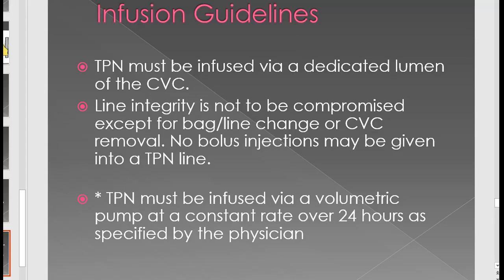As with any other kind of IV bags of any kind, it's only good for 24 hours. So at the end of the 24 hours when TPN has been hanging, you must discard it and get an order for a new TPN bag.